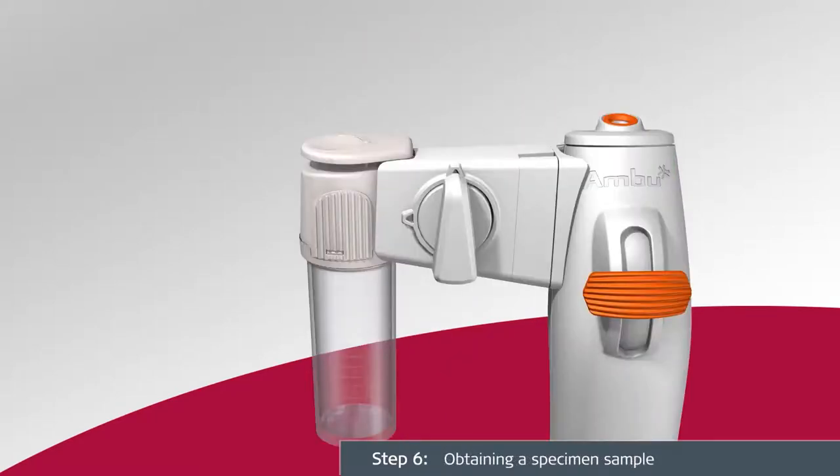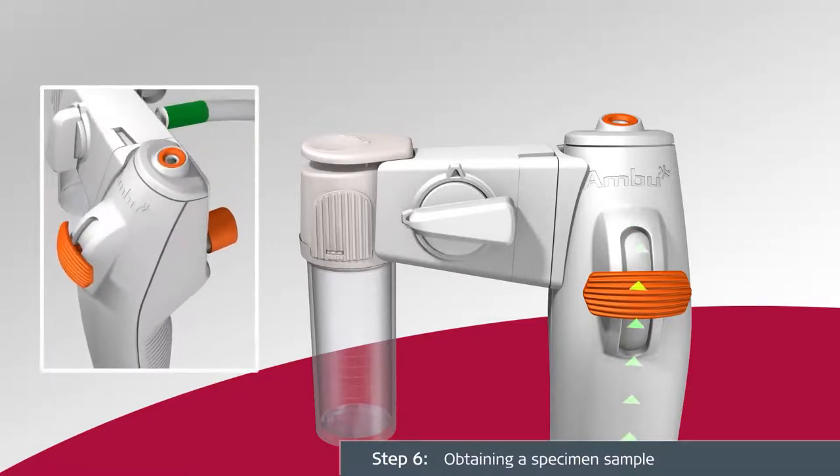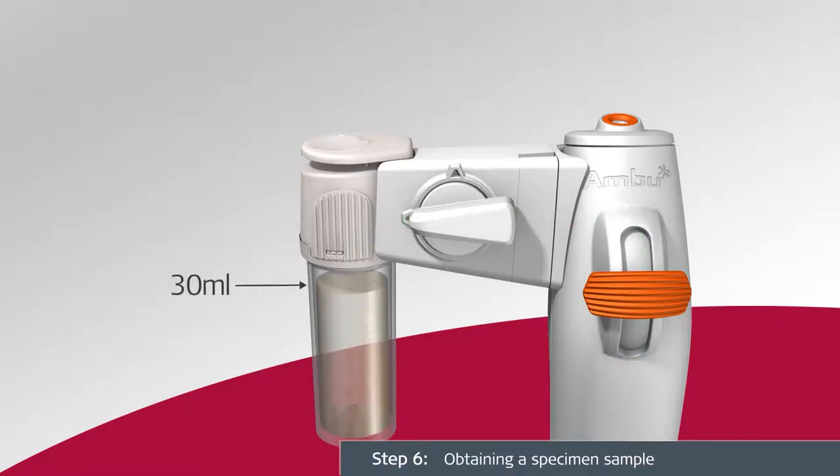To obtain a specimen sample, turn the flow switch counterclockwise toward the sample container and press the suction button on the A-Scope IV Bronco. Do not fill the sample container above the 30 milliliter volume indicator marked on the sample container. Keep the scope and attached Bronco Sampler in a vertical orientation.